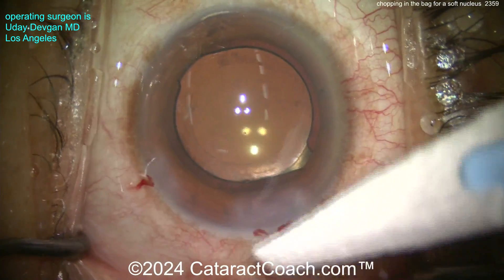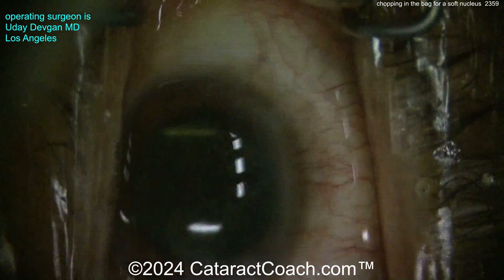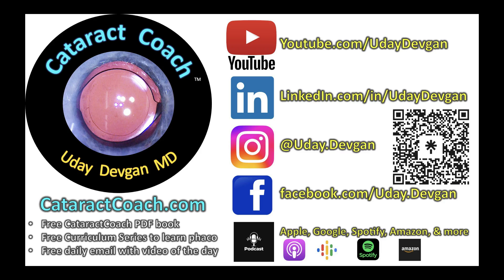Alrighty, beautiful case! Again, you don't have to flip it out of the bag if it's a soft nucleus — you can still chop it right in the capsule bag, just like we showed you. Remember to check out our teaching website, CataractCoach.com — so much great material. I promise you will love it and learn so much. There's a free email newsletter sent every single day. Check it out.